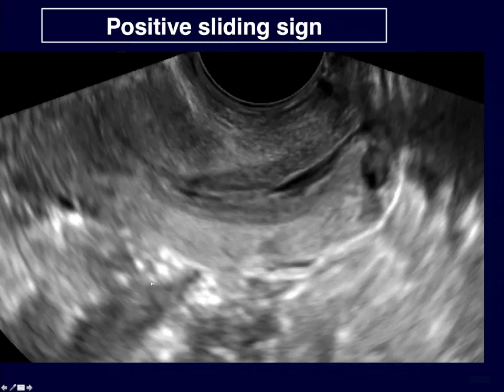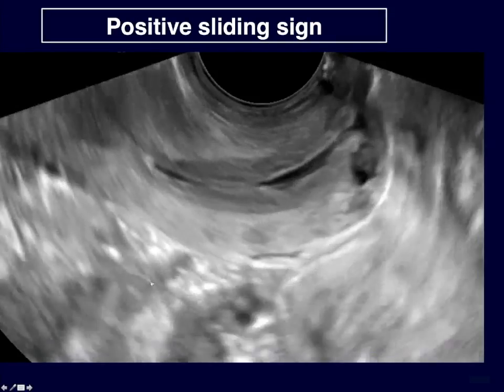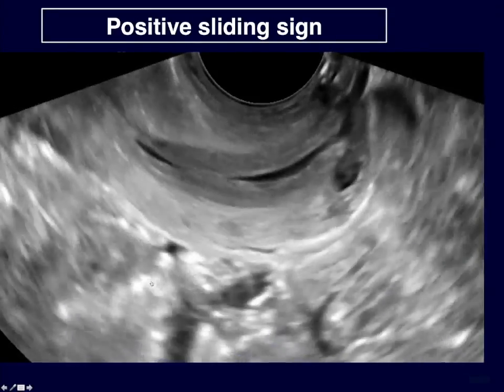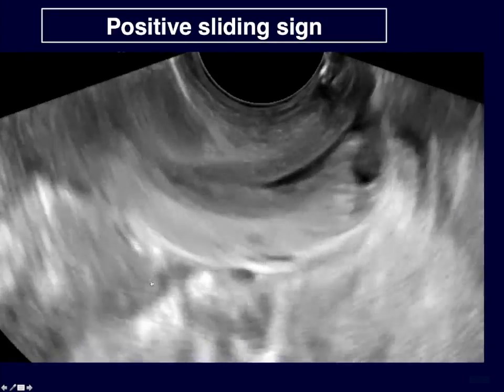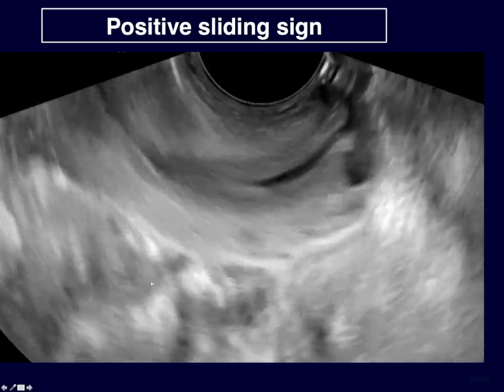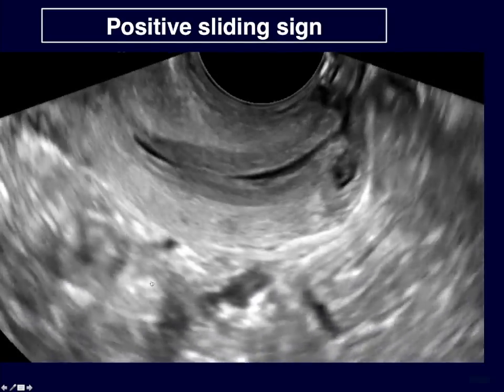Now, this is a normal case where you can see the cervix right here, and as we push the cervix, it glides normally across the bowel behind it. So this is a positive sliding sign. The prior example was a negative or abnormal sliding sign where the things do not slide.